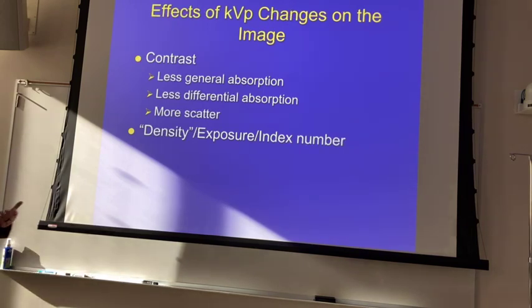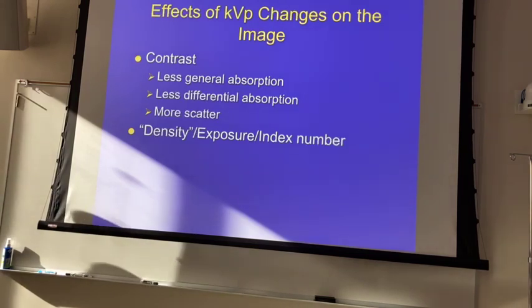So how would a change in kVp only affect your density or your exposure number?